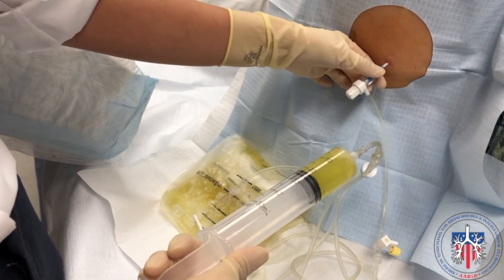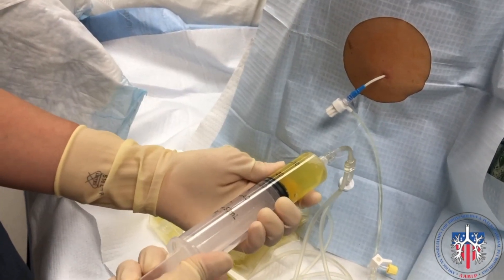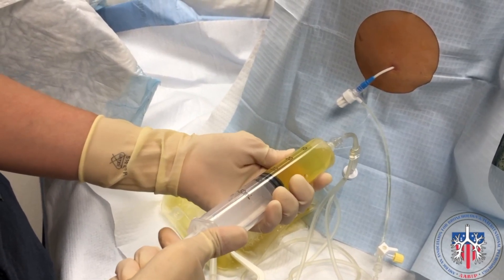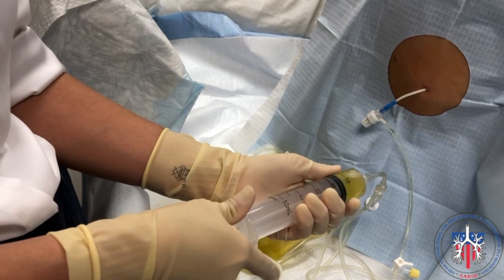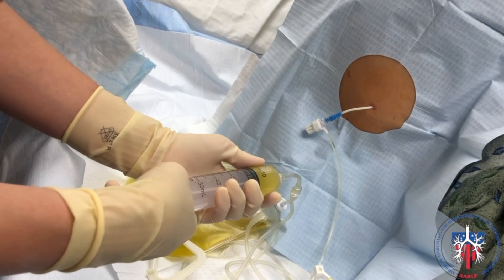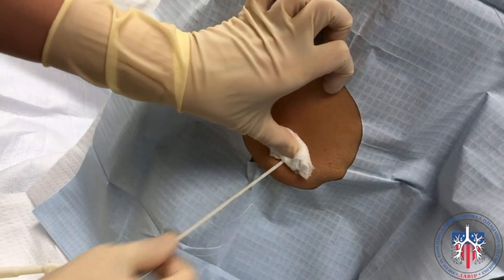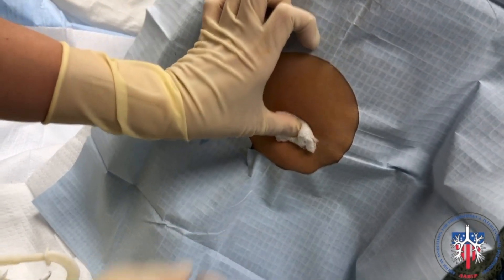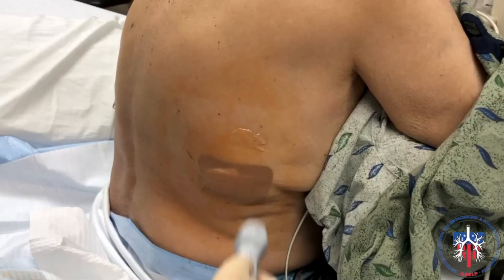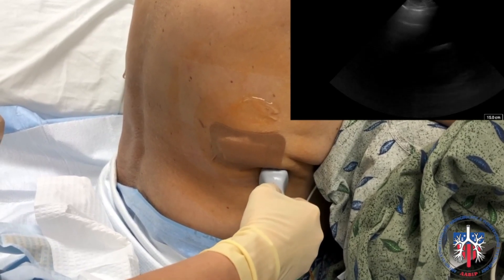When the outflow of fluid has stopped, pull the catheter out a little bit and continue to drain until the fluid is completely evacuated. Ensure that the patient knows to inform the physician when chest pressure occurs, to stop the drainage earlier. After drainage is finished, quickly remove the catheter at the end of expiration. Repeat pleural ultrasound after thoracentesis can also be performed to ensure complete evacuation of the pleural fluid if needed.